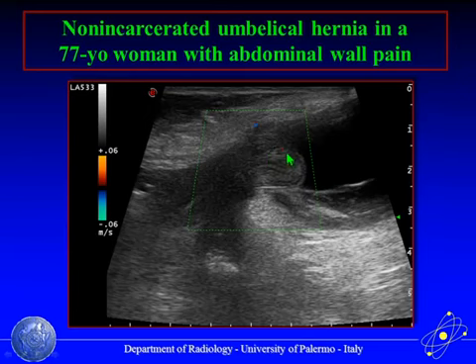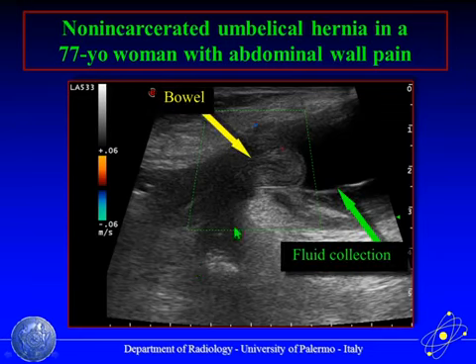There is maintained blood supply to this bowel loop. So the color Doppler module is useful to address this issue. The bowel and the fluid collection, and the color box demonstrating some colored spot into the wall of the bowel loop.